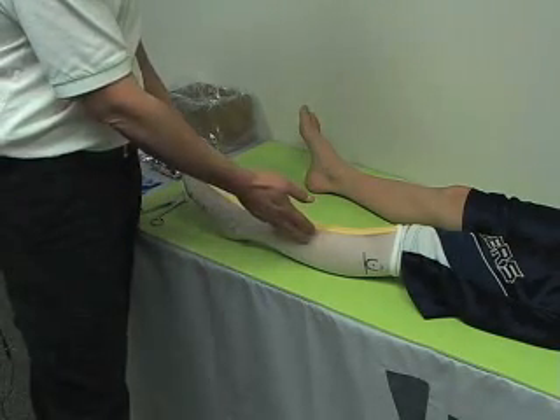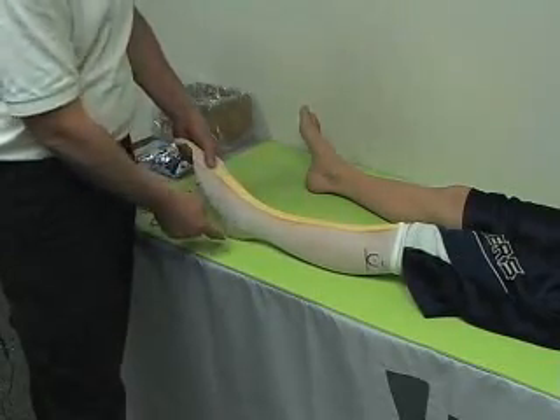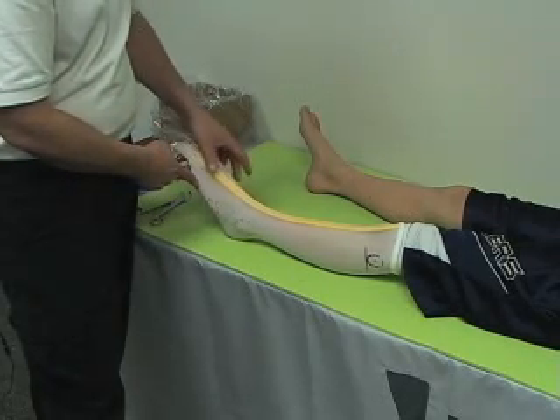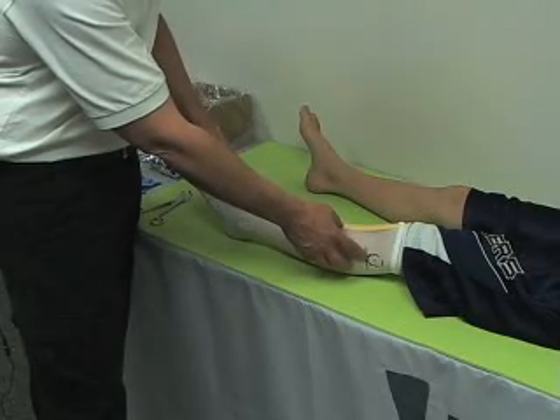We recommend using nylon, two layers with a cut strip in between, ideally marking the medial and lateral malleolus, the base of the fifth, the center of the first and fifth metatarsal heads, the navicular, and most importantly, the fibular head.